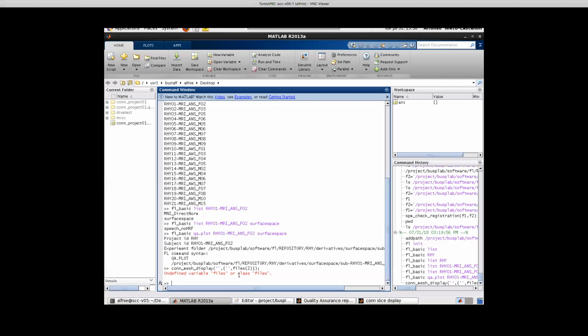So I don't think it'd be too much to ask for people, and for me to show people, how to look at these files using the FreeSurfer GUIs if need be. But you could make an argument that for the QA, what I mainly want is to facilitate or make it simple to detect common problems.